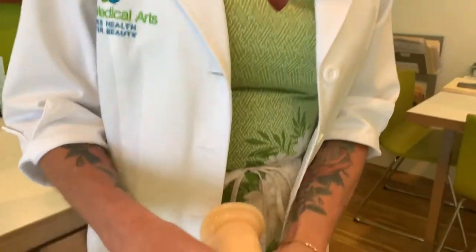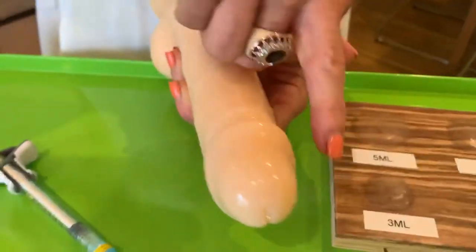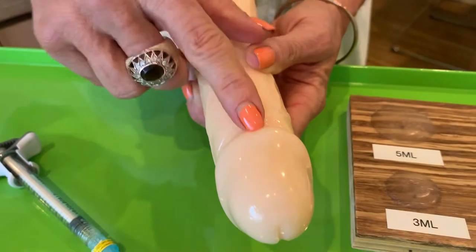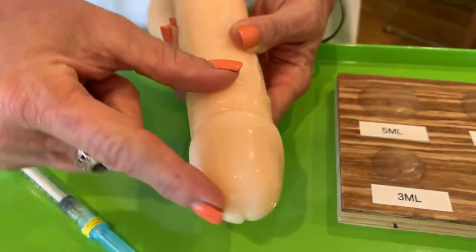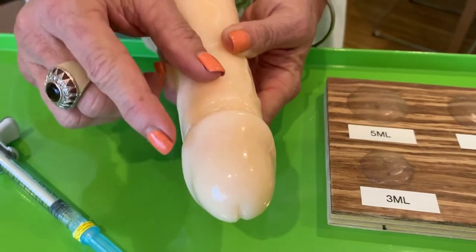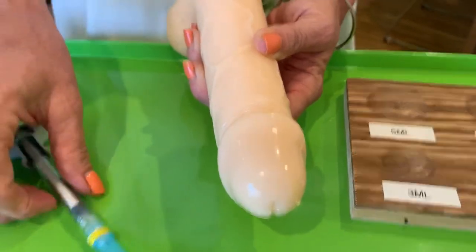So take a look. This is called the corona, and it is literally the crown of the glans. This is the entire glans. Believe it or not, this whole glans can take up to five mls.